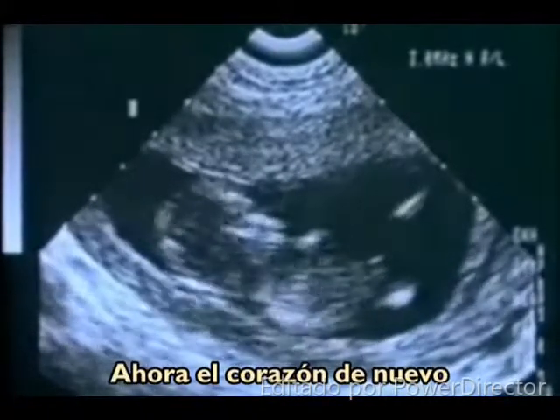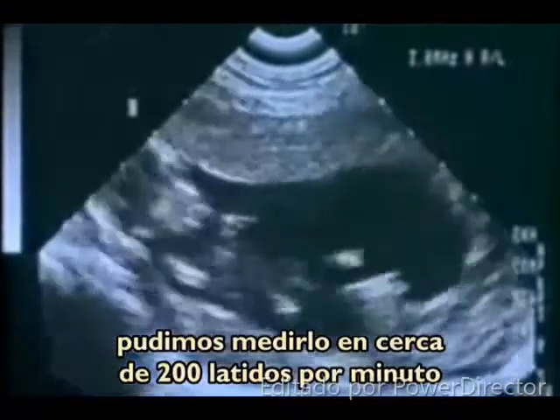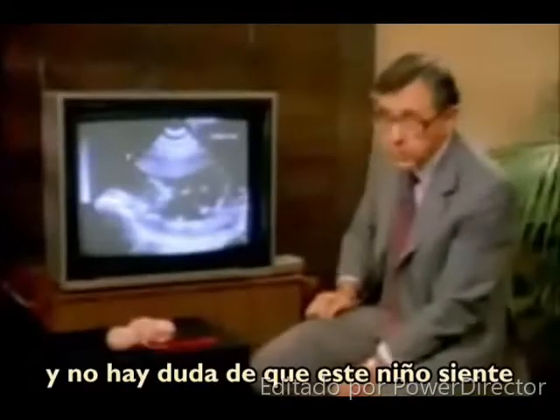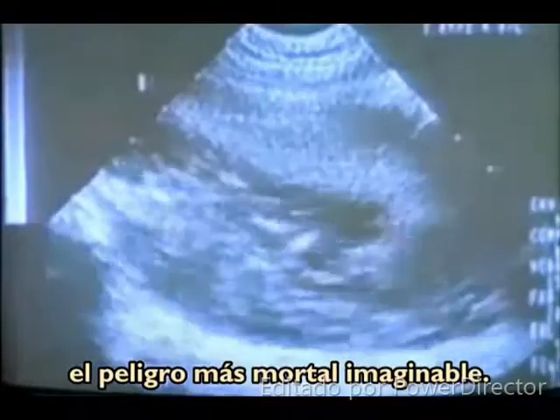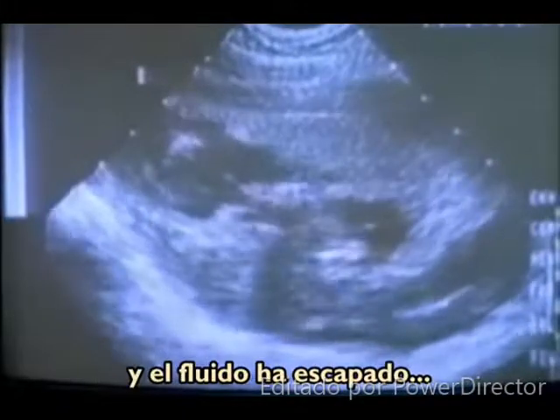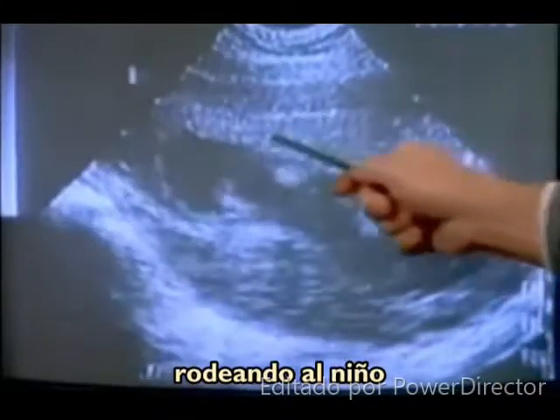Now, the heart has again perceptibly speeded up. We can time this at approximately 200 beats per minute. There is no question this child senses the most mortal danger imaginable. The membrane has now been punctured and the fluid has escaped. One no longer sees that large reservoir of fluid surrounding the child.